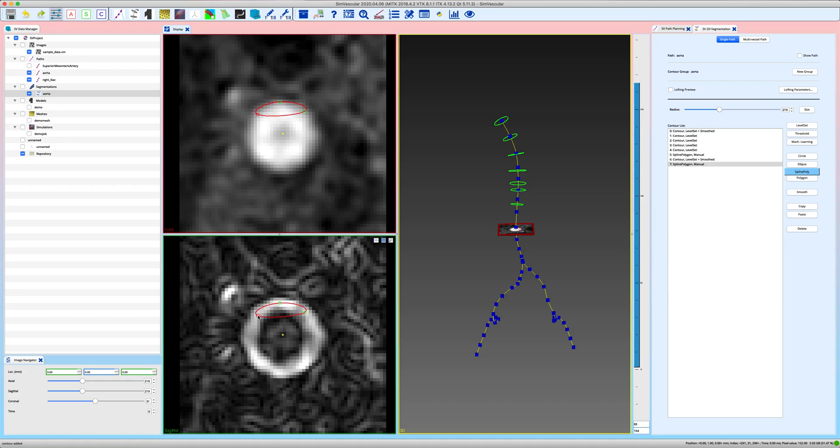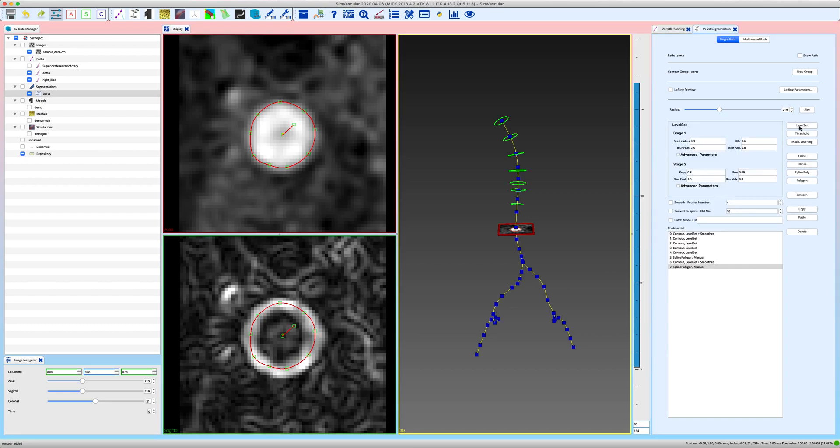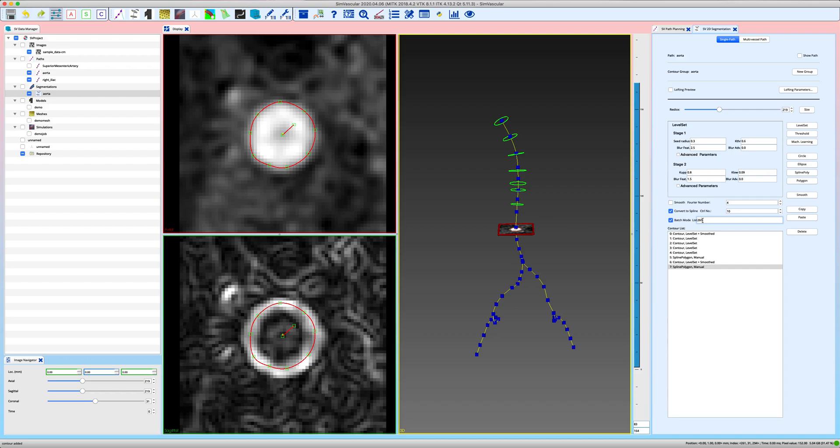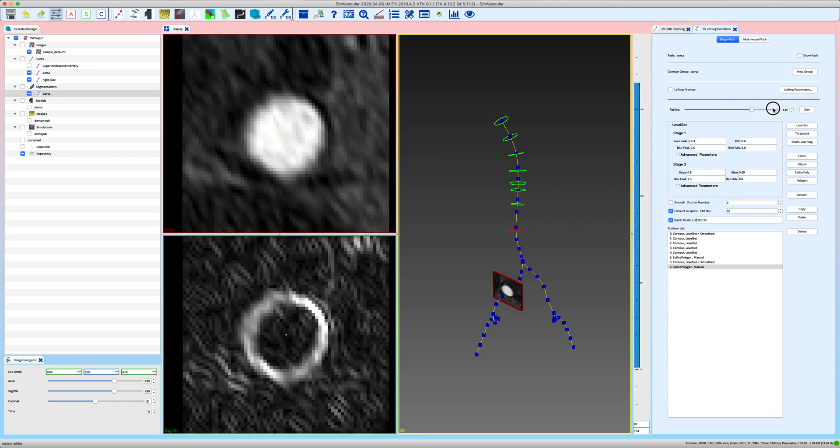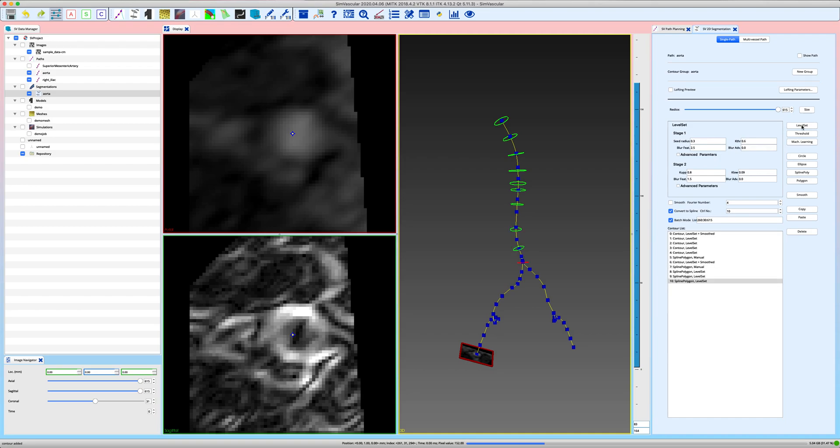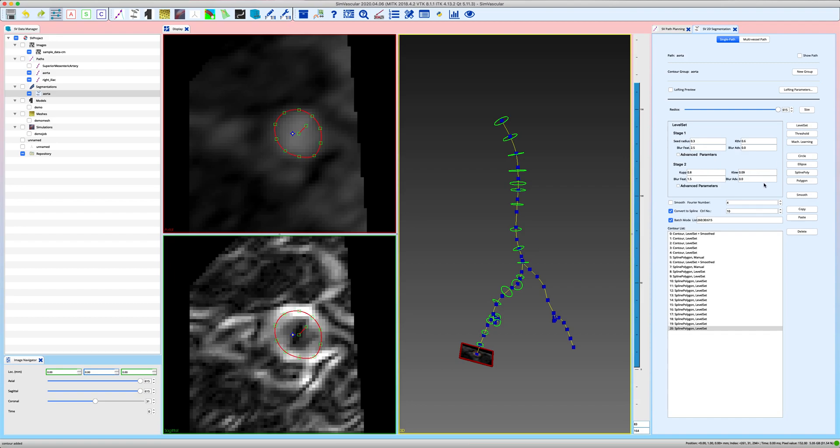Okay, and double click to finalize it. To speed things up a little bit you can use something that's called batch mode. For this I would toggle on the batch mode and again the convert to spline so that I can manipulate my resulting segmentations. And I am already at reslice plane number 219. So let's say I will start at 260, I will go in increments of 30 reslice levels, and I will continue this batch mode until the last reslice plane which is number 615. Okay, and then you just click level set again and it will create you a whole batch of level set segmentations just as you specified in your list here. I will toggle that off.